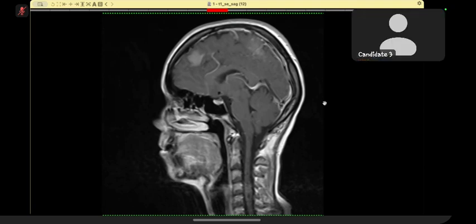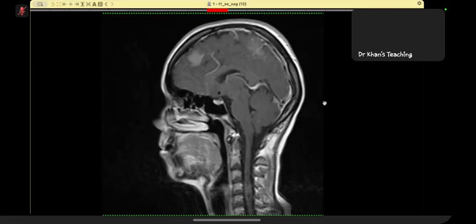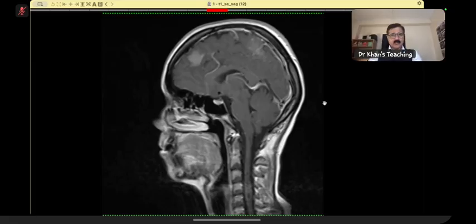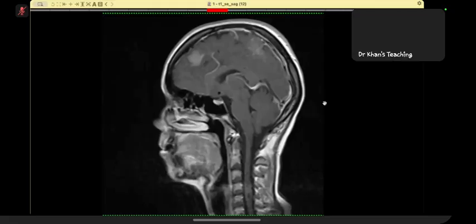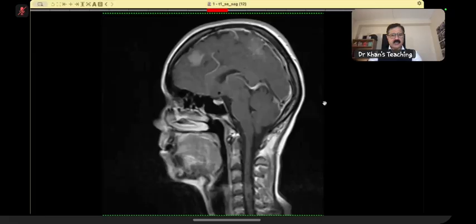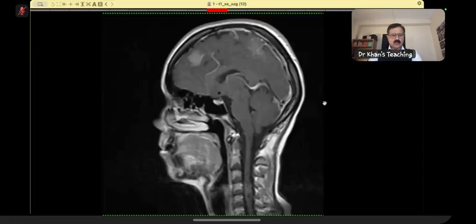With that, what else? Sir, clinical criteria can be the axillary freckling and many other things. That is NF1. You are confusing with NF1. Sir, what I am trying to tell you is that if a patient has multiple meningiomas and ependymomas, and what else did you say? Bilateral vestibular schwannomas. So in this case, were there any schwannomas?